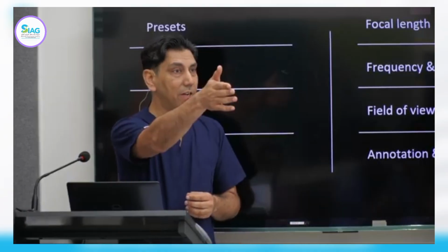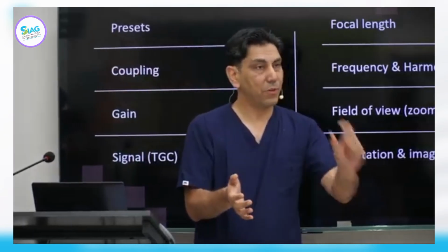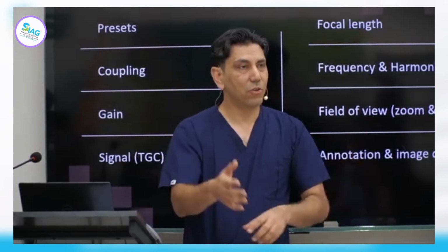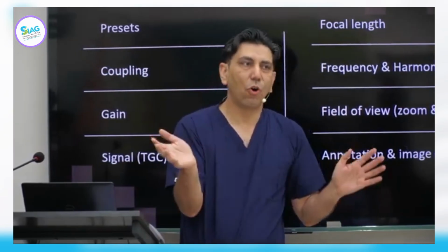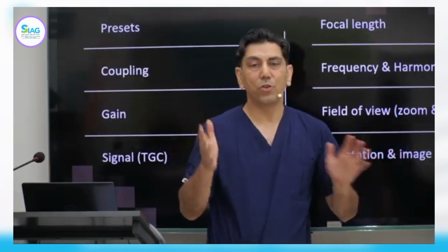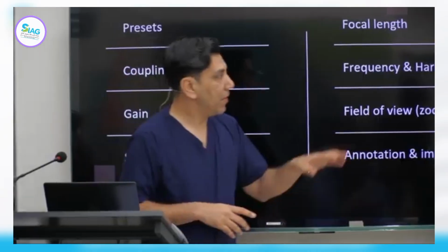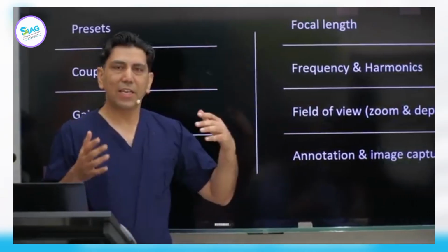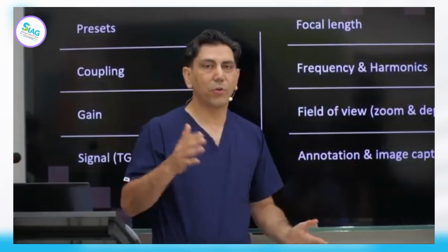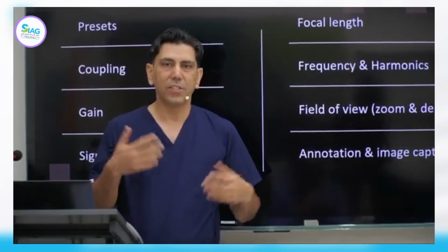As again, when we started in your case, Junaid, yesterday, we went into the room, we saw that the frequency was set at low, we increased it, we saw that the time gain compensation was all over the place. Somebody will come and clean your panel and it's all disturbed. So you want to go back to your base camp, you want to therefore have it set up. It's like moving on from driving a manual car to an automatic car. You don't actually have to think about changing the gear. Your car does it automatically.